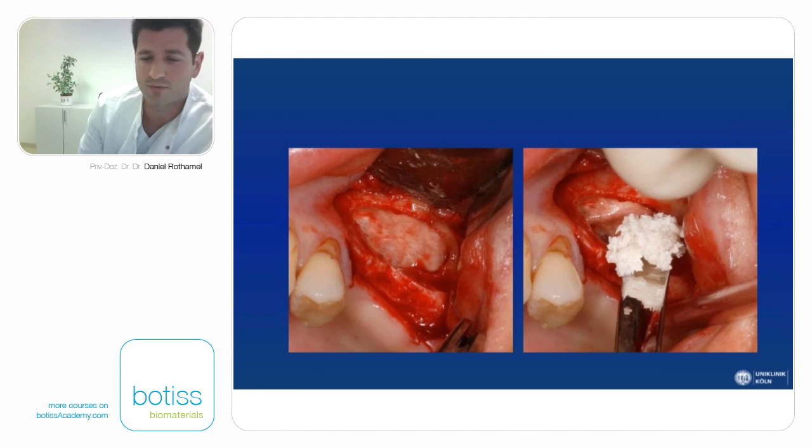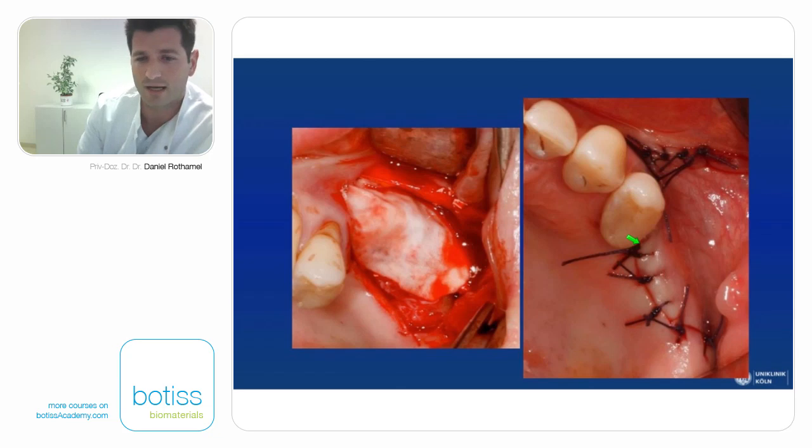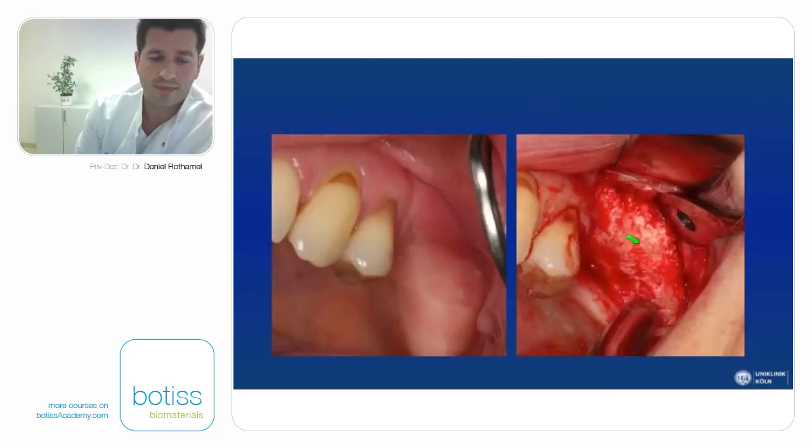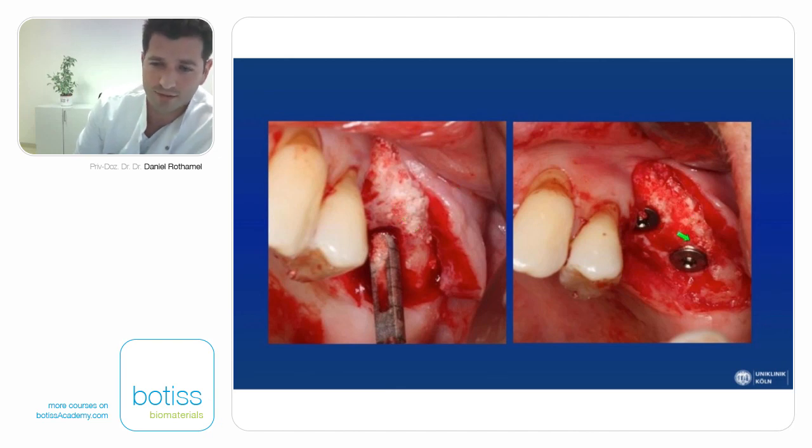So this is Maxresorb only into the sinus cavity, some Maxresorb with 20% of autogenous bone for the lateral aspect, application of this Jason pericardial membrane, again closure, and at the re-entry after 6 months, we can easily see that we have improved the width of the alveolar process tremendously. What we can see here again is the perfect integration of the bone substitute material into newly formed bone matrix. So we took 2 biopsies and placed 2 implants in this white bone that was starting with a very compromised situation.